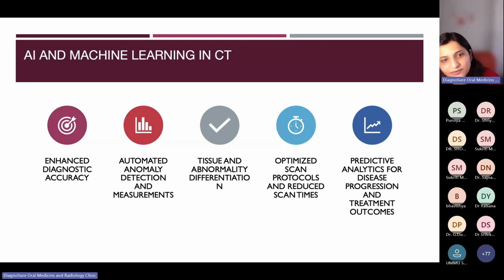There are software programs which prepare a complete report, and still the humans or the radiologists are the gold standard. They can just go through the report prepared by the machine and decide what to keep and what are the areas that the computer has missed out on. So these algorithms and programs are coming up. They will change radiology definitely in future.